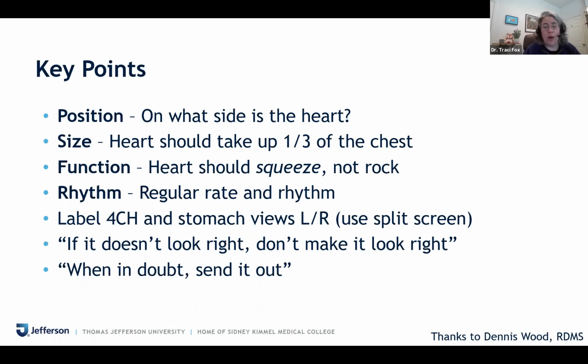The key thing is I'll question it. Remember, I'm a sonographer, not an obstetrician, so somebody else always has to look at my stuff. Usually it would be a perinatologist, and I would just tell them it doesn't look right, and that's all they need to hear. They're going to get a fetal echo done and try and figure out what's going on. Usually I can figure out what's going on, but still the official thing is they need a fetal echo.